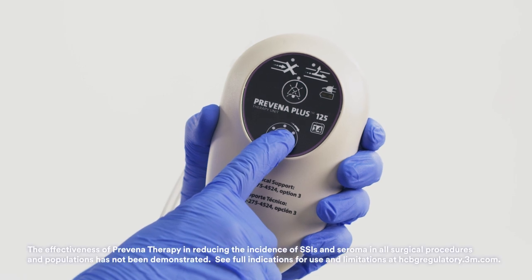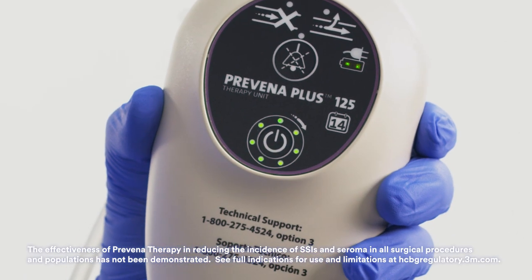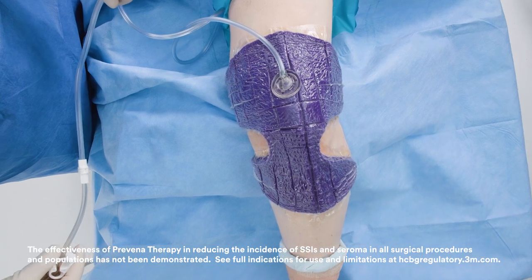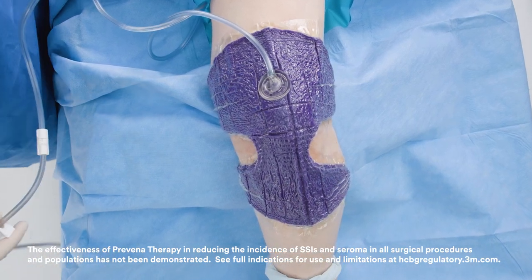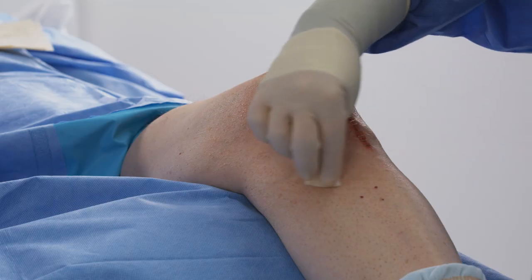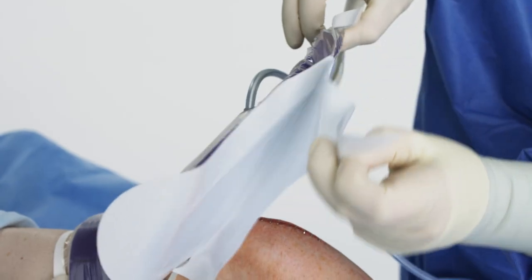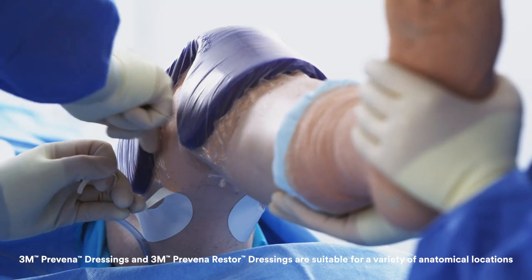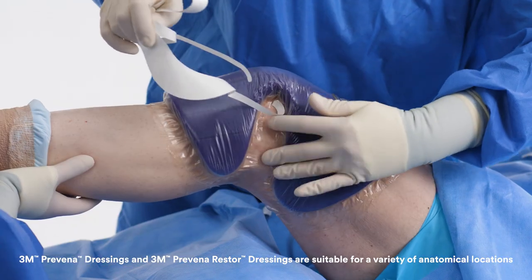Proactive risk management with 3M Praveena therapy aims to help advance the standard of care by helping to reduce the risk of costly post-operative complications such as infection associated with surgery in patients at high risk. In this video you'll learn a few tips and tricks to support safe and effective application of Praveena therapy on a closed incision after an orthopedic knee procedure.